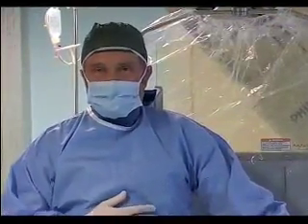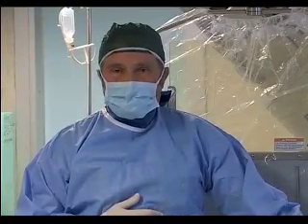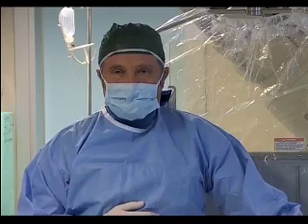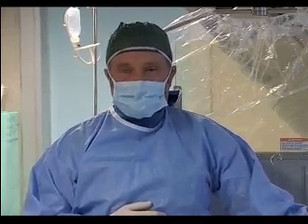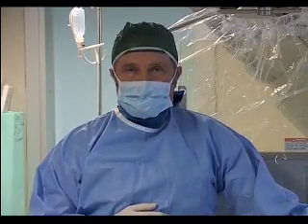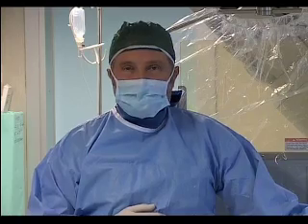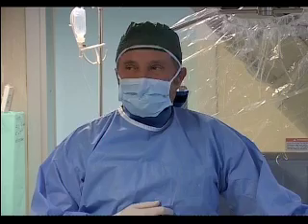Hello, Carlos? Yes. We were talking in the panel on the side about the age of the patient. So it's a 6 year old? Yes, correct. So what device are you going to use? Well, I would like to know your suggestions, Carlos.